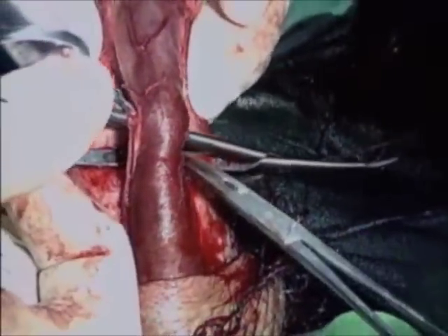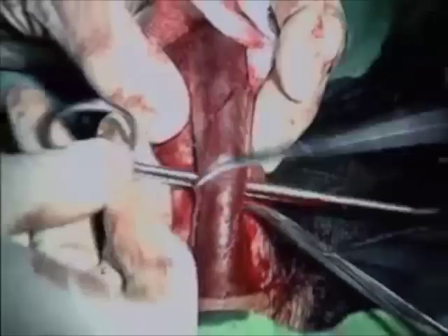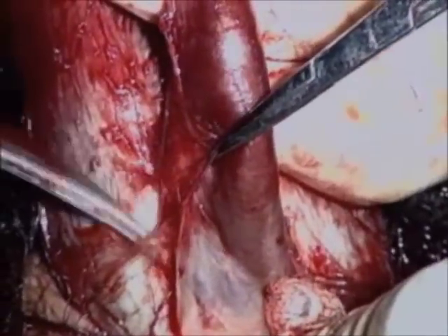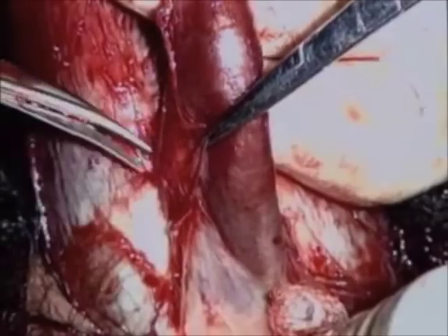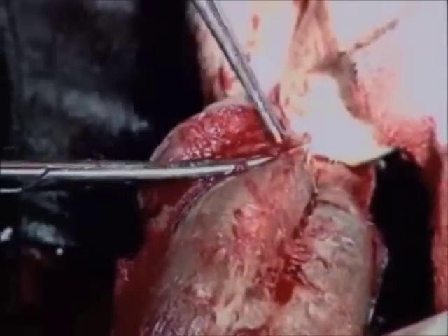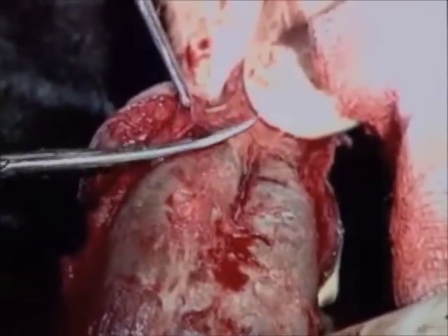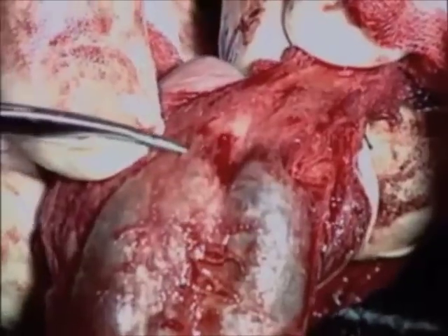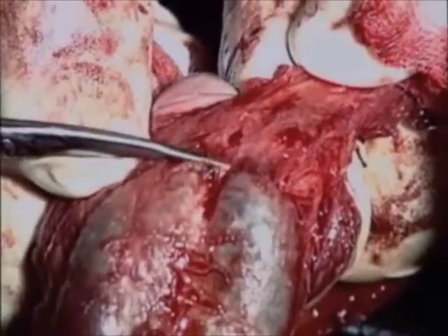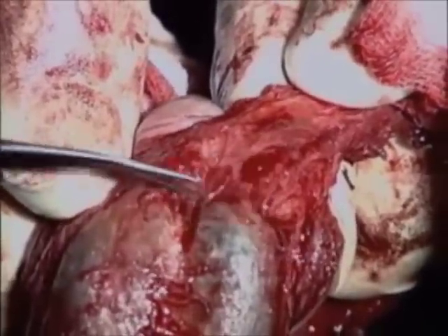Dissection is performed proximally up to its bulbar part and distally towards the glans cap. Lifting of the glans cap is performed closely to the tunica albuginea, being cautious not to injure the dorsal arteries, which run collaterally ventrally into the glans. Fibrous attachments between the glans cap and the tips of the corpora cavernosa are divided.